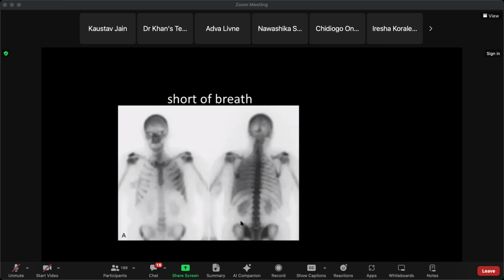I've not actually seen this in real life, but I assume that this could be an inflammatory process in the lungs, and there is a focal uptake within the ribs and in the posterior left mid-zone as well, which could suggest a focal carcinoma with some inflammatory changes elsewhere, but is definitely not normal, and I would correlate it with chest X-ray findings to evaluate this further.